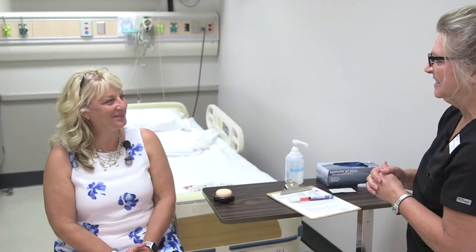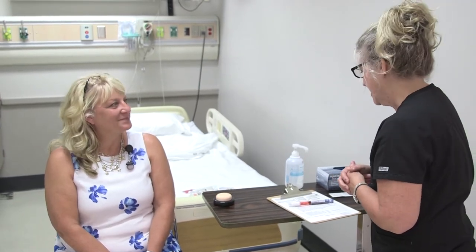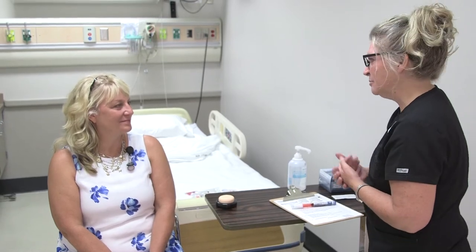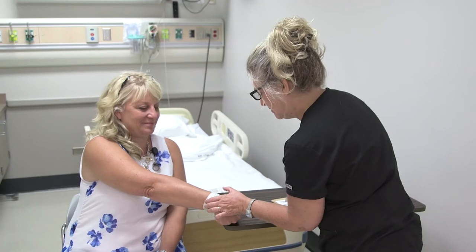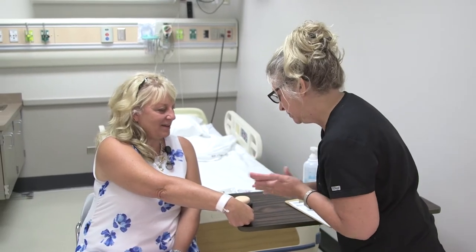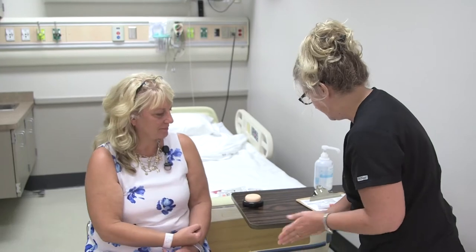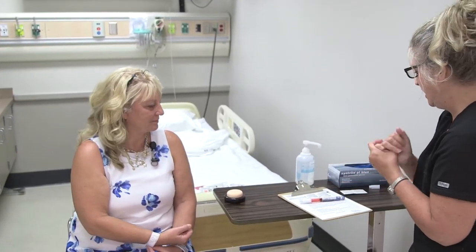Hello Sylvia, I'm Mary from CVTC Technical College — I'm a student nurse here to give you your Lantis injection this evening. I just want to double check: would you confirm your full name and date of birth? — Sylvia Vasquez, 1/30/1966. Excellent, that matches my chart. Are you allergic to anything? — No. Wonderful.